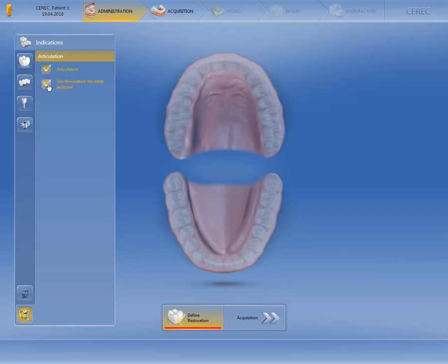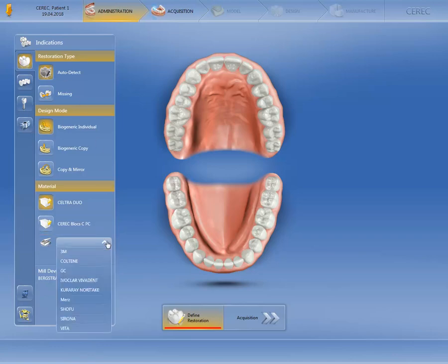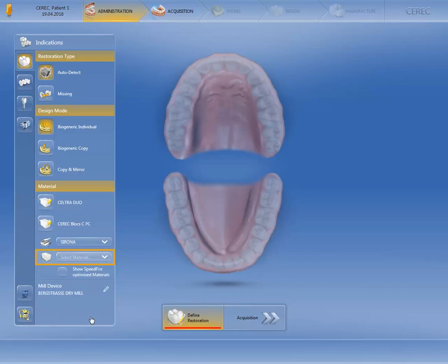For our case, we will deactivate both functions again and switch back to the Single Tooth Restoration indication. For demonstration purposes, let us select a new material. We open the drop-down menu, select the Material Manufacturer, and then the Material.